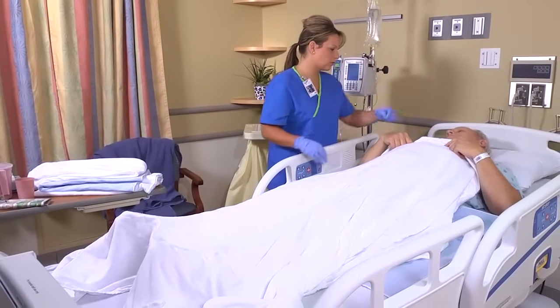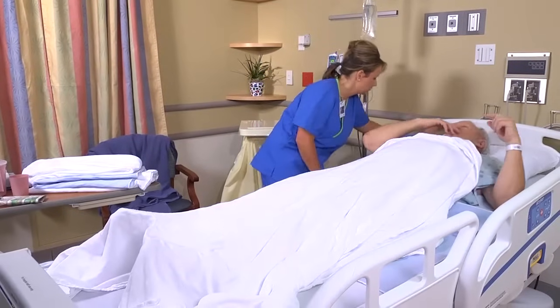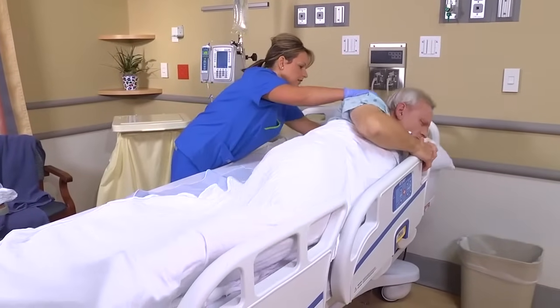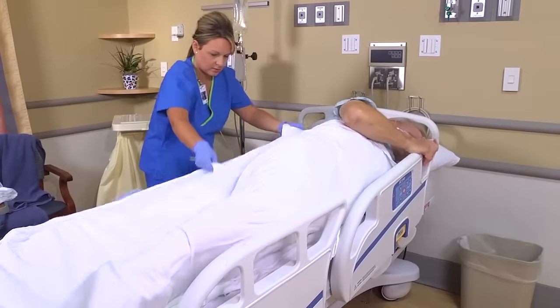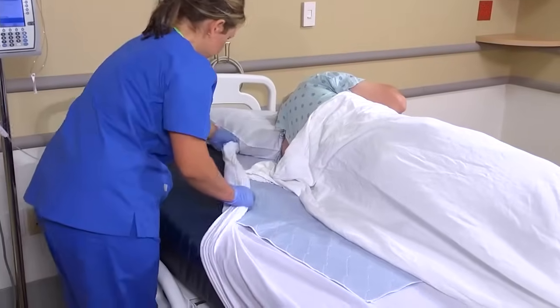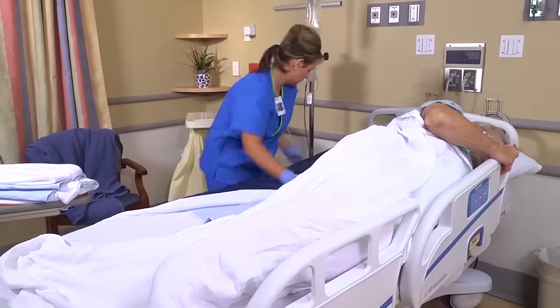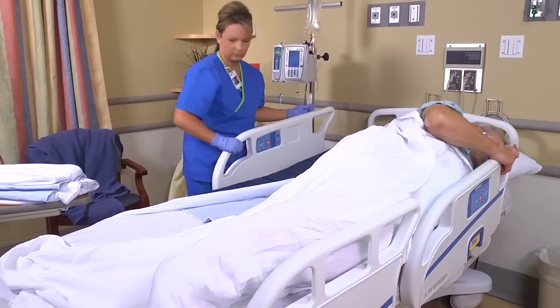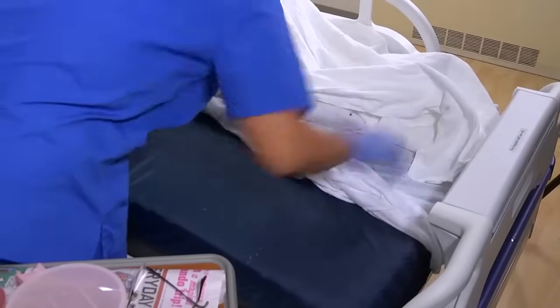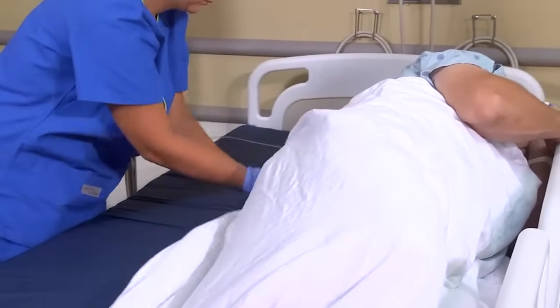Lower the rail on your side of the bed. Help the patient into a side-lying position, facing away from you. Encourage him to use the side rail to turn, then adjust the pillow beneath his head. Make sure no tension has been placed on any external medical devices, such as indwelling catheters, wound drains, and IV tubing. Standing on one side of the bed, loosen the bottom linen moving from head to foot. Fan fold or roll the bottom sheet and any optional linen toward and under the patient. Tuck the edges of the soiled bottom linen alongside the patient's buttocks, back, and shoulders.